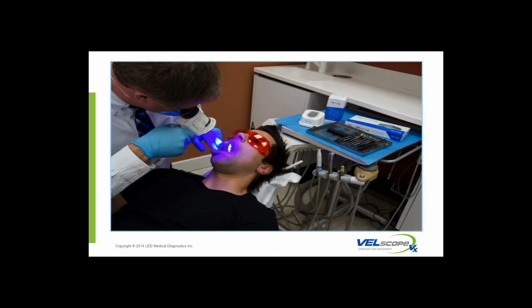So this is the VELscope. It's handheld, portable, rechargeable, much smaller than that previous unit that I shared with you. You can see there's a blue light. We're presenting that directly to the oral cavity. Again, no discomfort. You can see there's goggles that the patient has on. It is not required. It's just for patient comfort because it is a bright light, but no one else in the operatory needs to wear them.